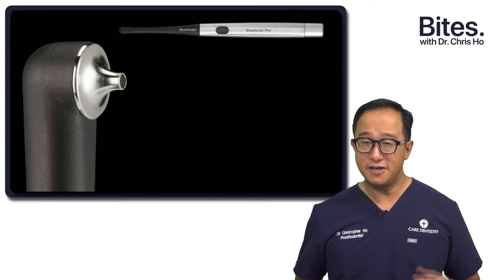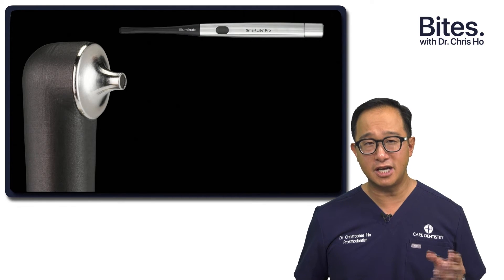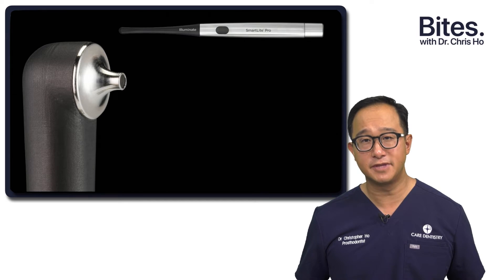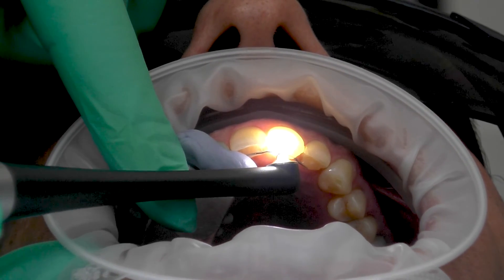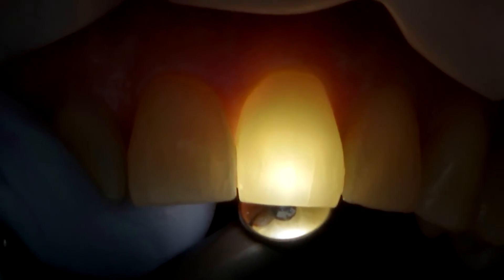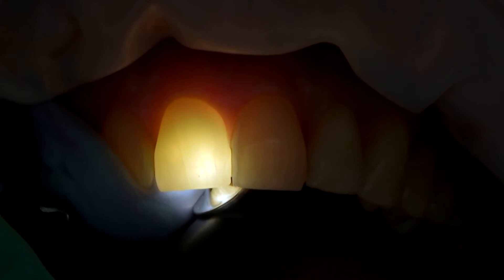Another unique feature is the trans-illumination tip. It's not just a curing light — it also comes with a trans-illumination tip, which changes the light to a white light in a very narrow beam. That narrow beam can be used to place around teeth to see if there's any caries or any fracture lines within teeth.